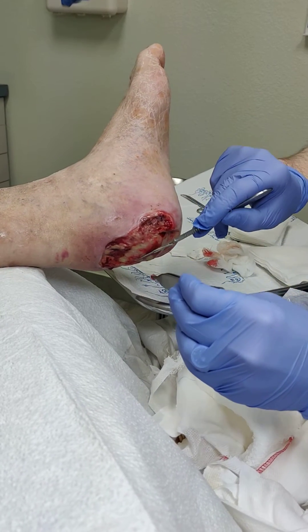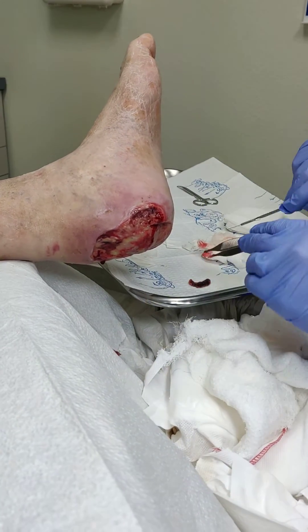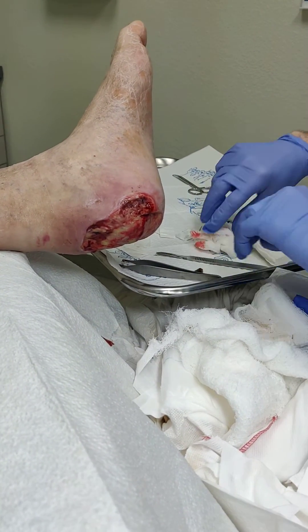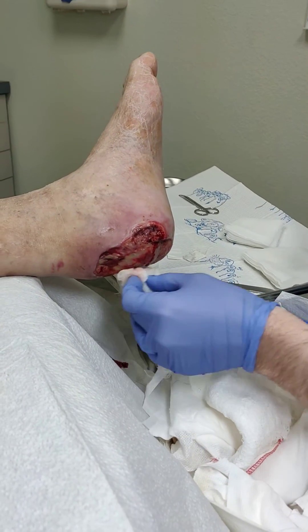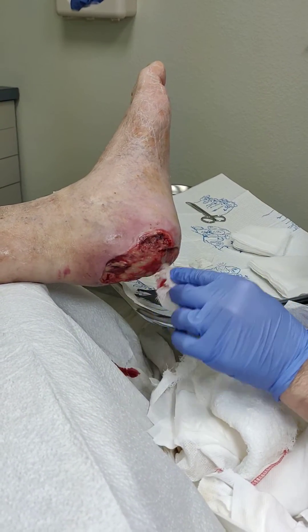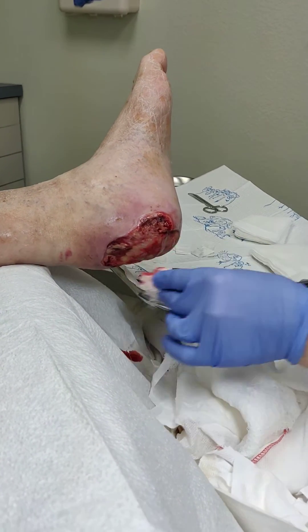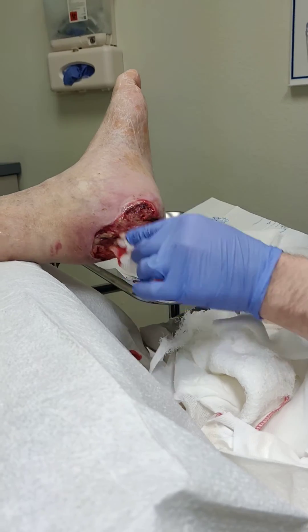The heel bone used to be exposed on this patient, but we managed to remove some of the superficial cortex to get to that good bleeding bone. Underneath the heel bone, the skin is going to grow right over that after the granulation tissue does. And beautifully, we have this red granulation tissue here covering that heel bone now.